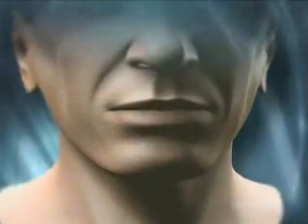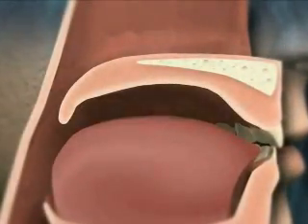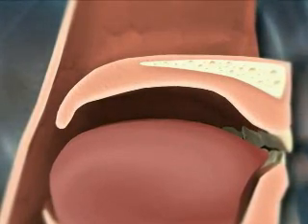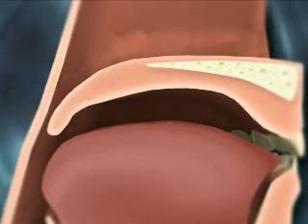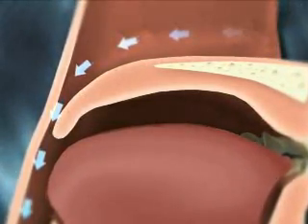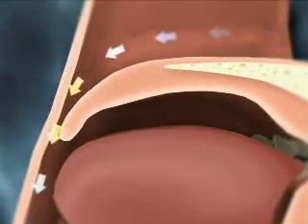The pillar procedure is an effective first-line treatment for the palatal component of sleep-disordered breathing, including snoring and obstructive sleep apnea, commonly referred to as OSA. It is designed to produce a lasting effect without surgically removing or damaging tissue. First, let's examine how the palate can cause or contribute to snoring and sleep apnea.